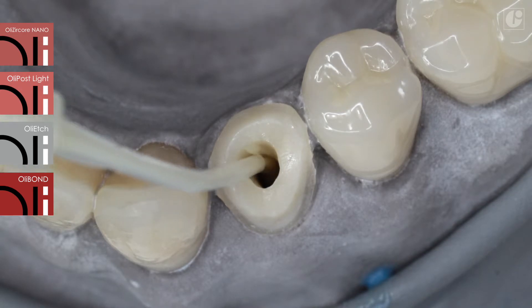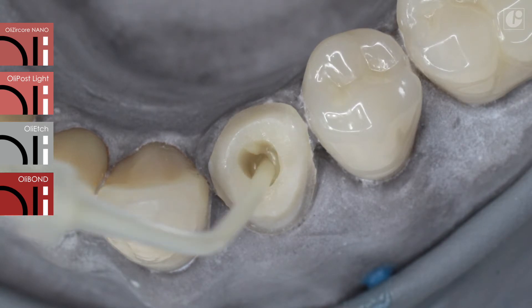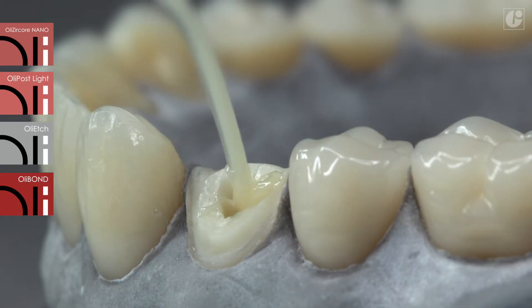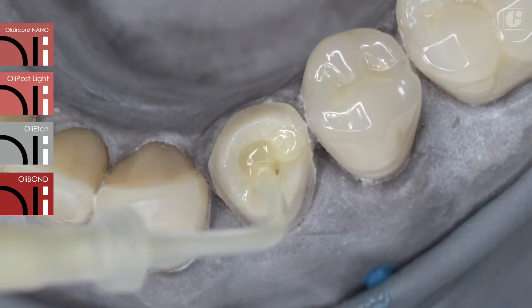The OliCircore Nano set includes long and flexible tips for material application directly into the root canal. Beginning from the very bottom of the canal, the syringe needs to be retracted slowly. It is essential that the tip is submerged all the time. This helps to avoid the formation of air bubbles.